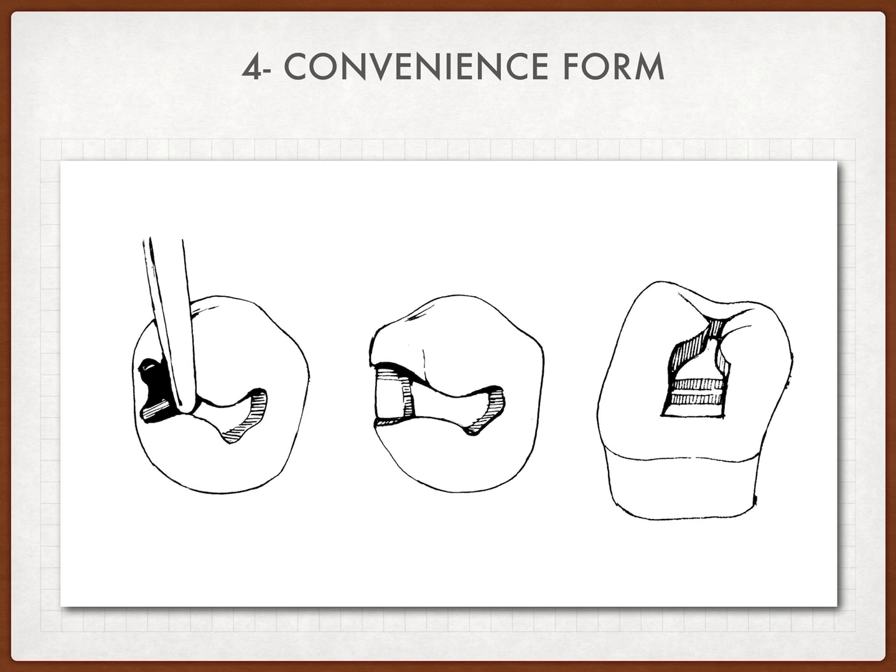But when we bring the base, like the zinc phosphate cement base, and try to condense it, the condenser will not go in. This is the case with me. I always try to make it as small and beautiful as possible, but when I bring the base and put it in the preparation and try to condense it, the condenser will not go in. Why?